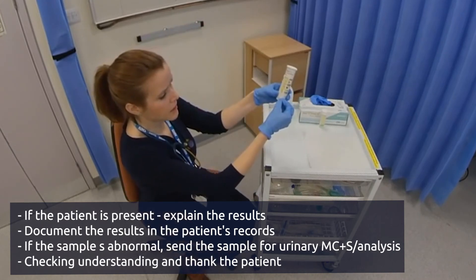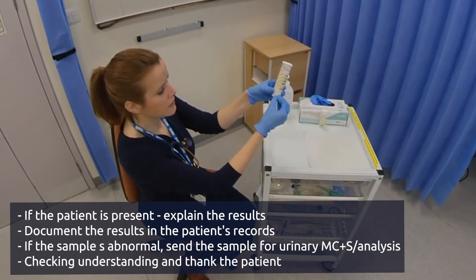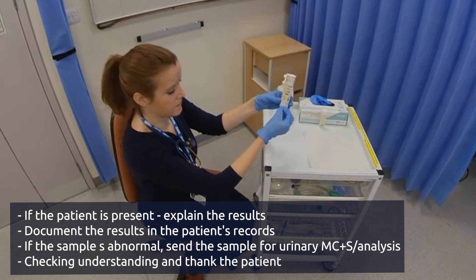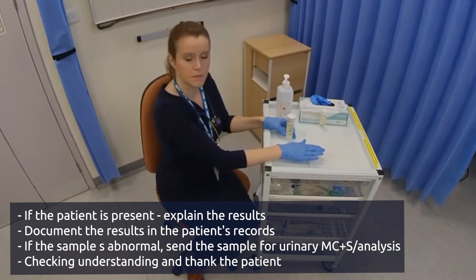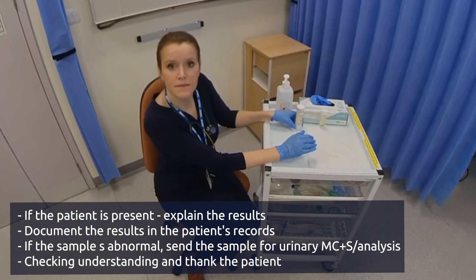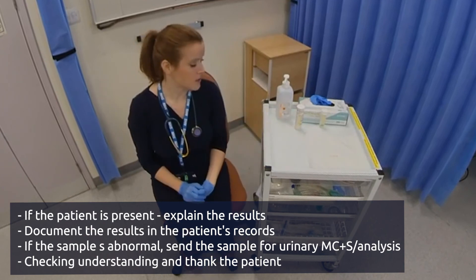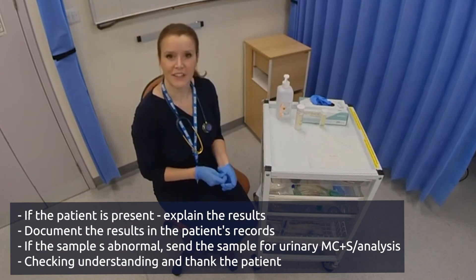You can see it's a pH of about 6. It's negative for protein, negative for glucose, negative for ketones, and negative for blood. You then dispose of the urine stick and report your findings. In this case you would say that it's a normal urine dipstick. Thank you.